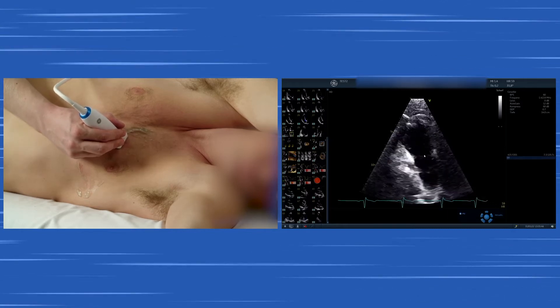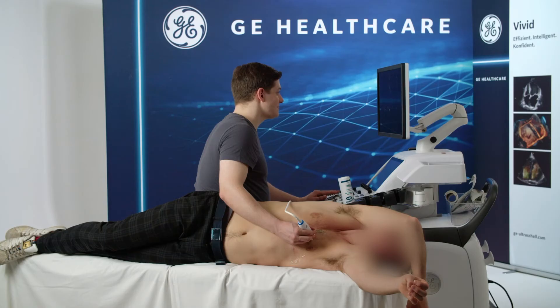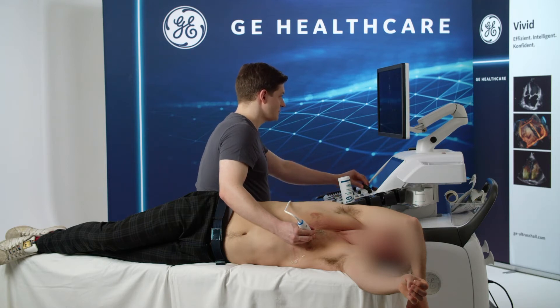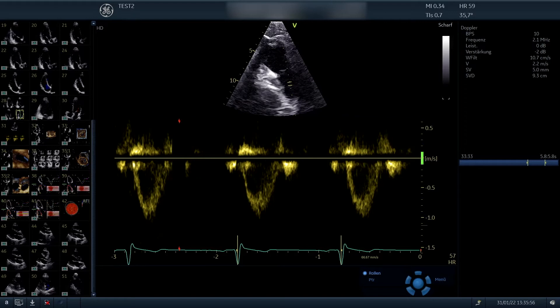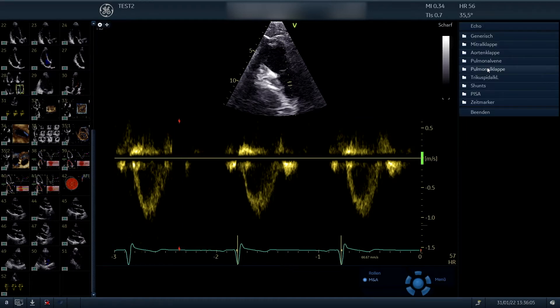What you also can do is activate the pulse wave Doppler. With the help of the pulse wave Doppler, you see the outflow of the right ventricle and you can measure several measurements here. For example, one measurement would be the pulmonic acceleration time. It's the time from the beginning till the maximum velocity which denotes a certain time interval.